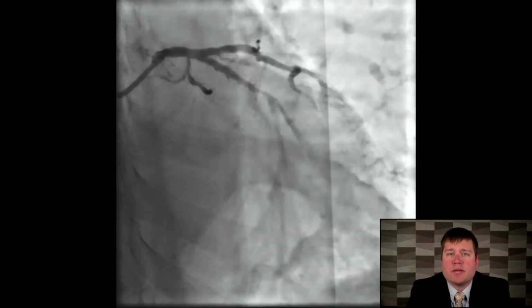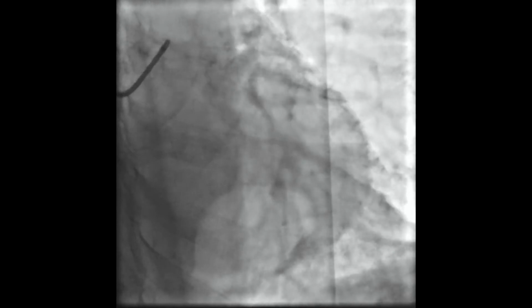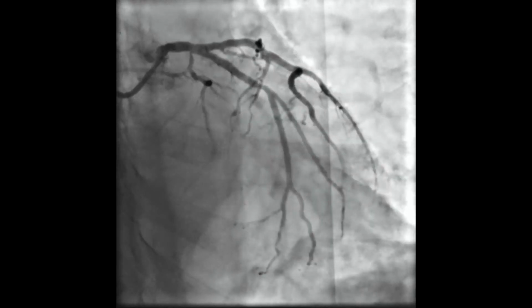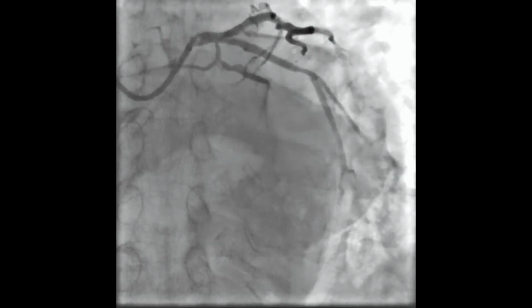So this is a case of a patient, 68 years old, with a history of an RCA CTO and an ostial circumflex stenosis, on carvedilol and ranolazine with low blood pressures. MRI showed that his RCA was infarcted. He had circumflex ischemia that was intermediate risk, but came in with intractable symptoms, and the plan was to proceed with intervention on the proximal circumflex.